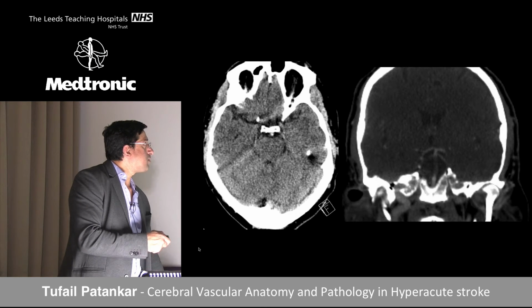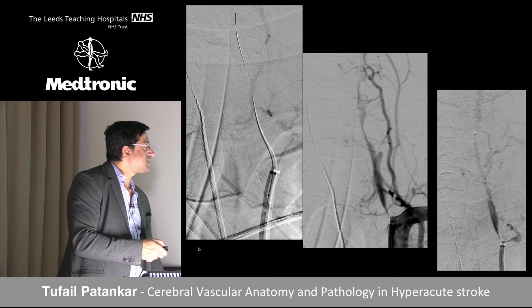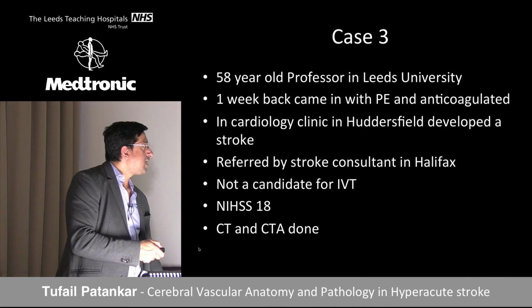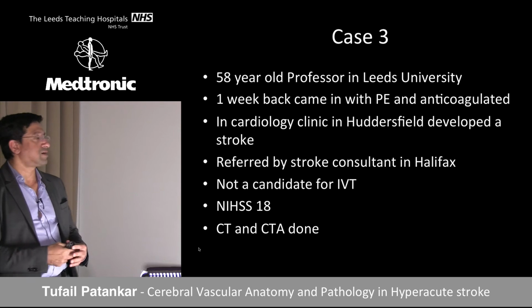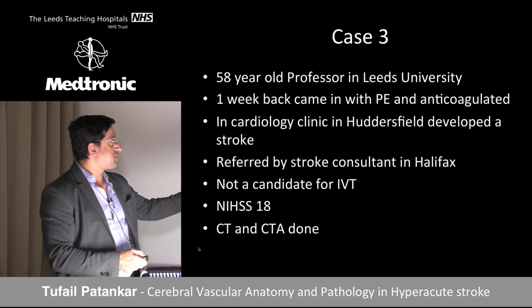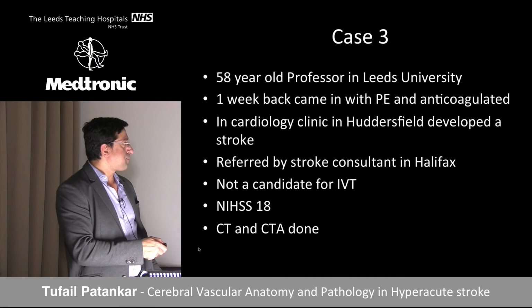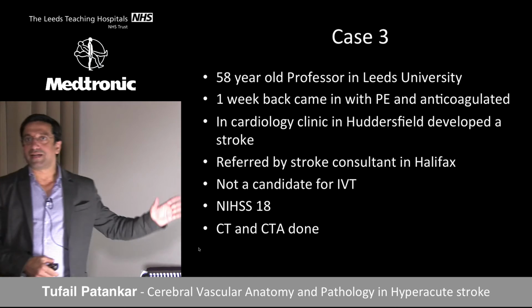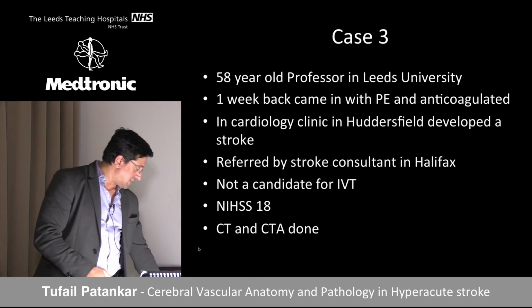This is another one, same story. Basilar artery. This is a little bit complicated, so I will take that. This was a professor in Leeds University, who came in and was referred to us. He had been in the cardiology clinic, and we couldn't thrombolyse him. NIHSS of 18, CT and CTA.